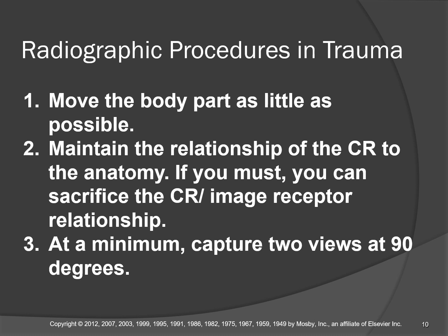Okay, so the central ray and the anatomy, that relationship, however that manifests. For example, everybody knows for an AP elbow, you extend the arm palm up, and then the X-ray enters in the middle of the bend, right underneath the bicep. There's a little depression right there where the bicep ends, right? Everybody knows that the central ray enters right there, okay? Now imagine that you can't straighten the arm.